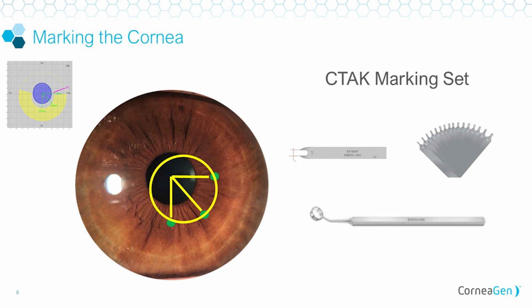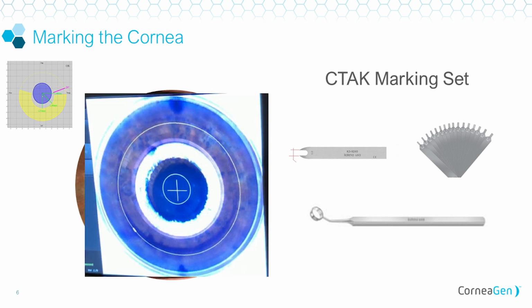Obviously, KC cones are not centered on the cornea, so we need to decenter the segments in just the right way from the pupil in order to then set our femtosecond laser, as you see here, to give us a channel in the exact coordinates that we need. Again, decentered from the pupil and properly encompassing the keratoconic cone.